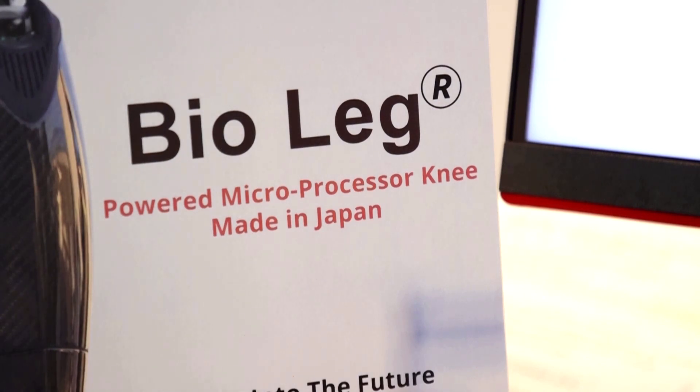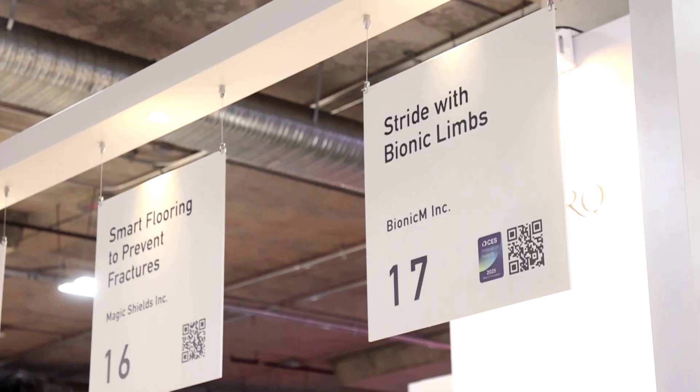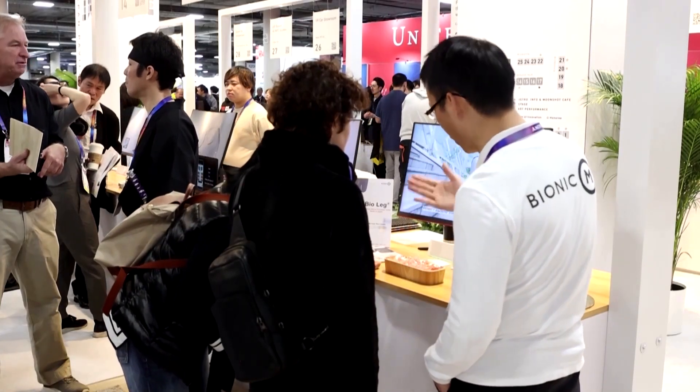At this year's CES Technology Expo in Las Vegas, the BioLeg's design won best of innovation in accessibility.